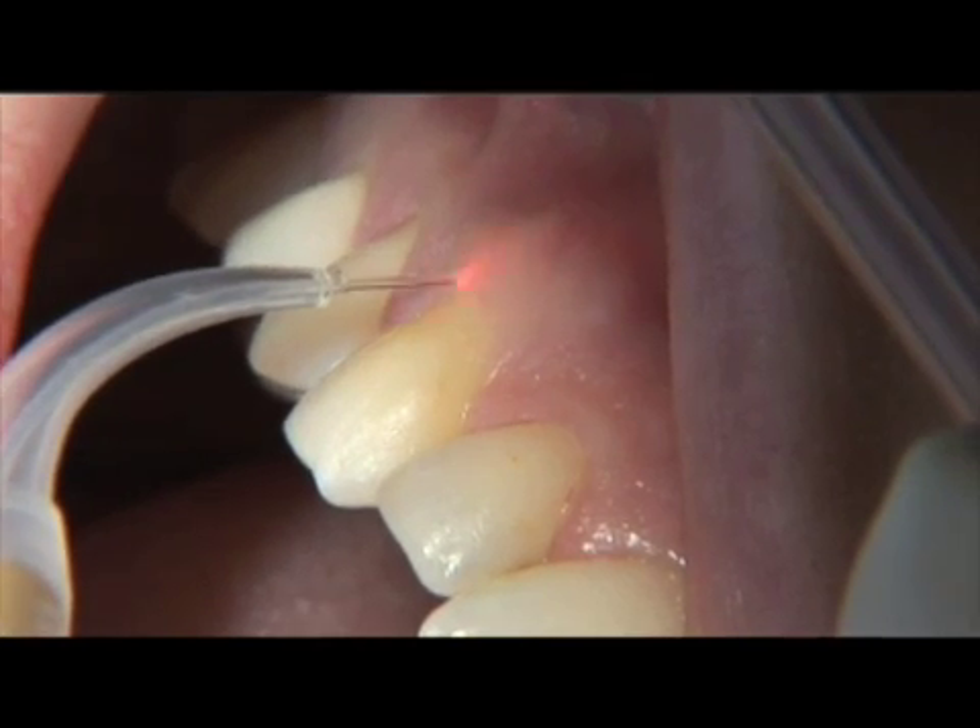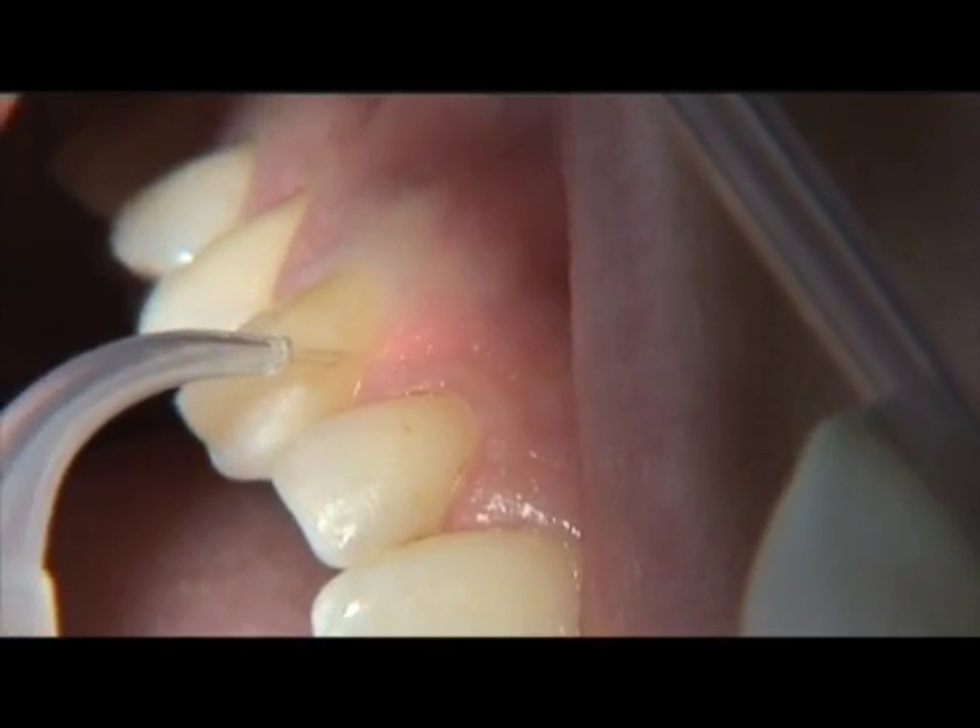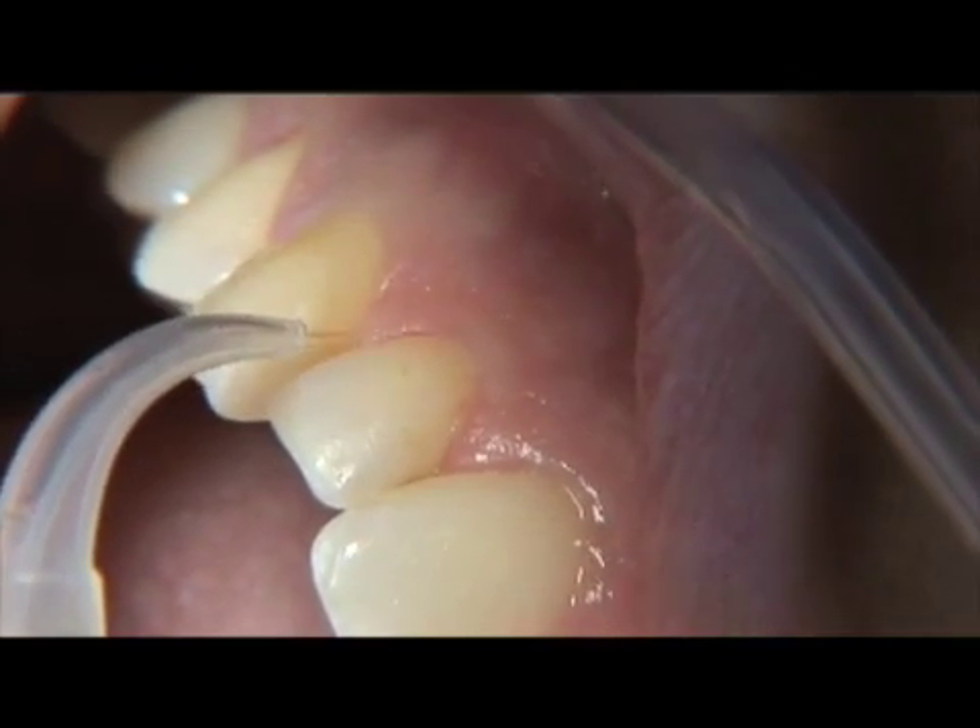Remember, the clinician, assistant, and patient must always wear wavelength-specific safety glasses during laser procedures.